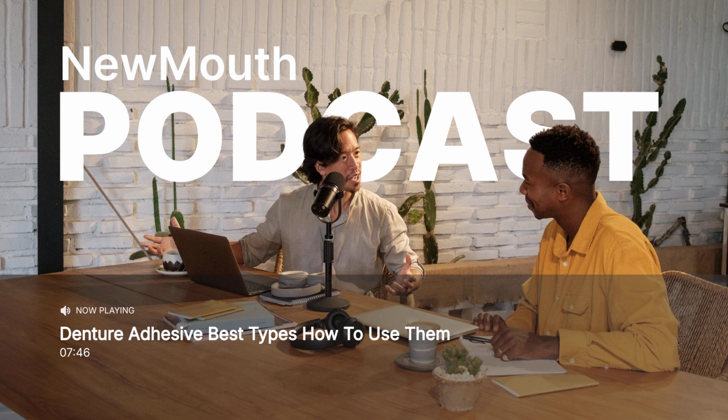The American College of Prosthodontists came out pretty strongly recommending that people avoid long-term use of anything with zinc, because if you get too much, it can lead to some other health problems. Okay, so if you're using it every day, that's when you really want to be mindful and look for the zinc-free options. Got it. Absolutely. Weigh those benefits and the potential risks. Got to look at the whole picture. So zinc-free, definitely something to keep in mind, especially for those everyday users.